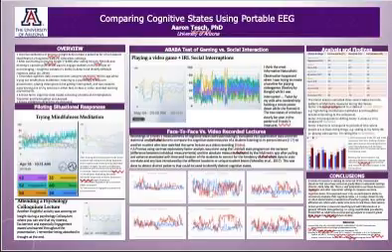And as you can see with the graphs that my Emotiv could produce, during the meditation their measures of engagement went up, and the measurements of stress went down, the measurement of focus went down, the measurement of excitement went down, the measurement of interest kind of stayed stable throughout the entire session. And I don't know what the measure of relaxation was doing, but it went down for the entire meditation session.